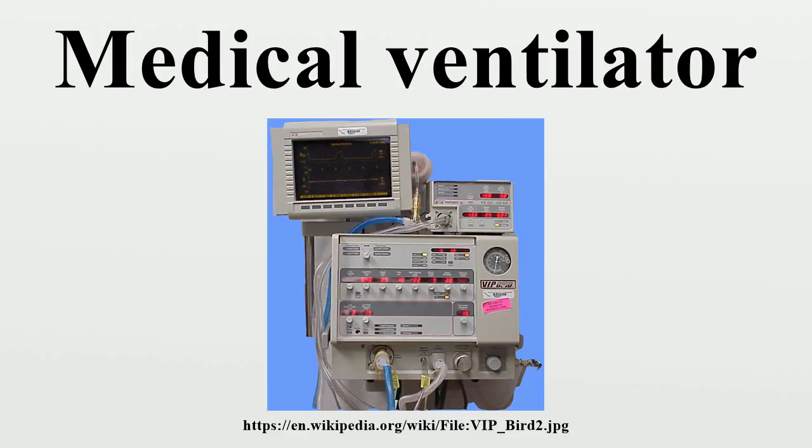Medical ventilators are sometimes colloquially called respirators, a term which stems from commonly used devices in the 1950s. However, in modern hospital and medical terminology, these machines are never referred to as respirators, and a use of respirator, in this context, is now a deprecated anachronism which signals technical unfamiliarity.